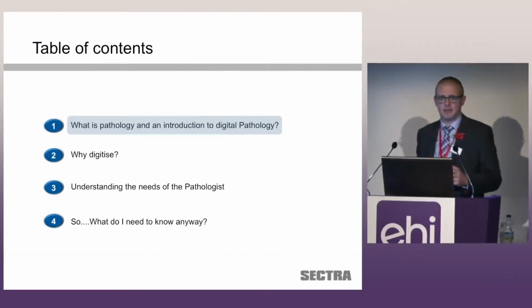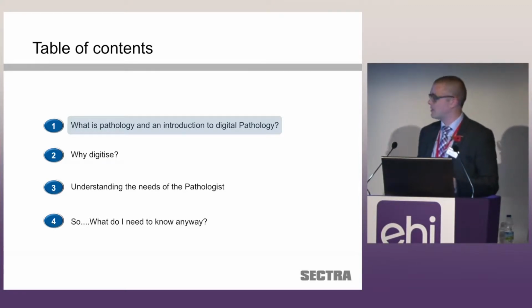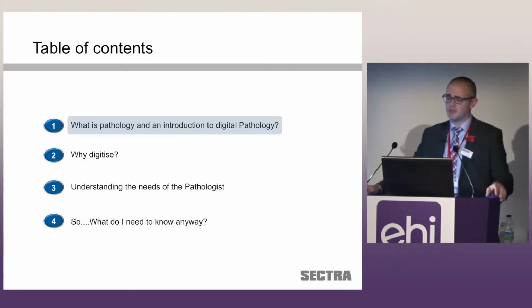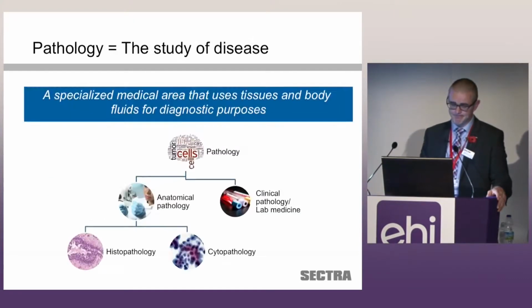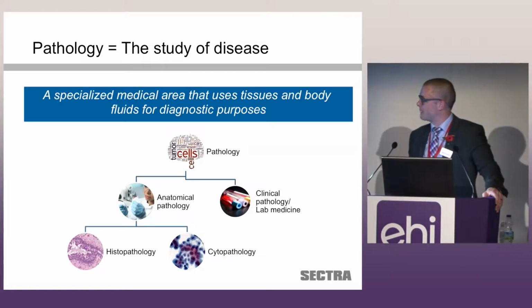So I appreciate that in the crowd here today there may be quite a lot of IT people, so for that reason I'll spend just a few moments talking about what pathology is and a very brief introduction to digital pathology. So pathology is split into two main areas. Well, first of all, it's the study of disease, but it's split into two main areas: anatomical pathology and clinical pathology.